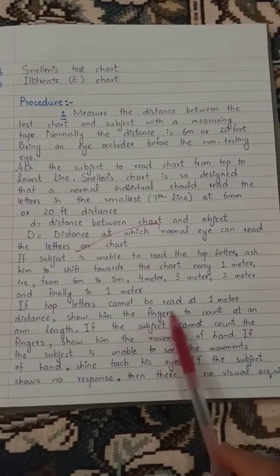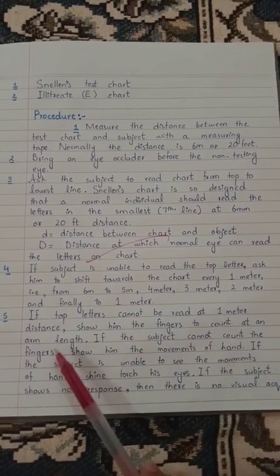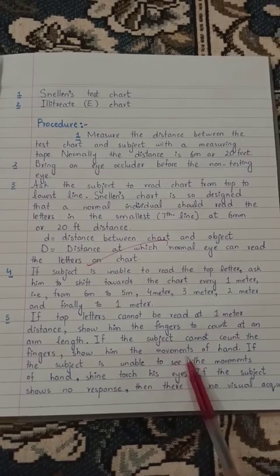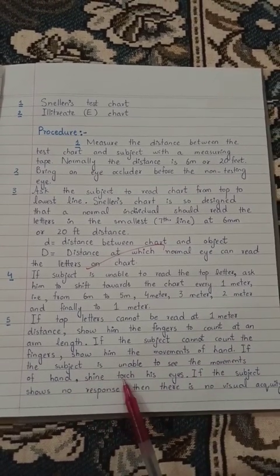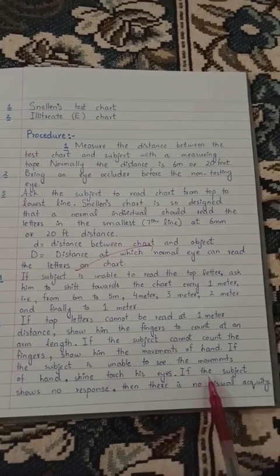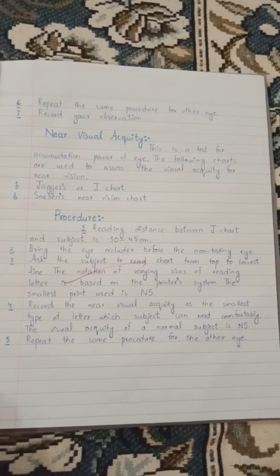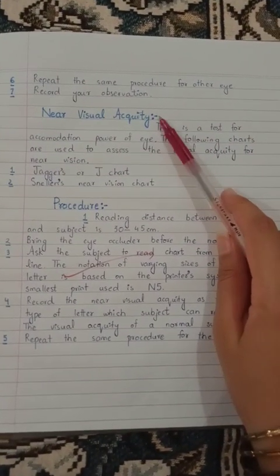If top letters cannot be read at 1 meter distance, show him the fingers to count at an arm's length. If the subject cannot count the fingers, show him the movements of the hand. If the subject is unable to see the movements of the hand, shine a torch in his eyes. If the subject shows no response, then there is no visual acuity. Repeat the same procedure for the other eye and record your observations.